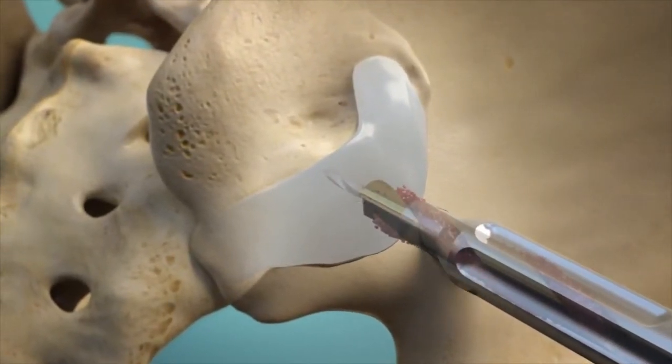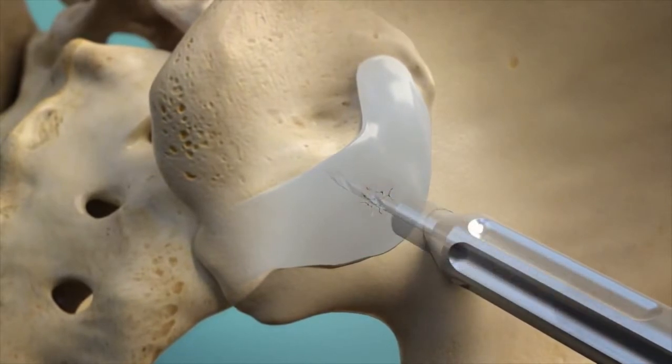After docking the working cannula to maintain position, the drill is removed and the sacral surface is prepared for decortication with a scraper and suction.